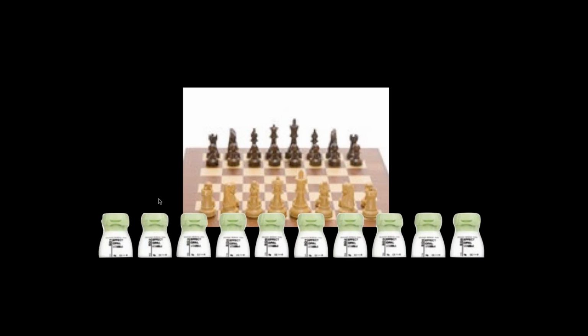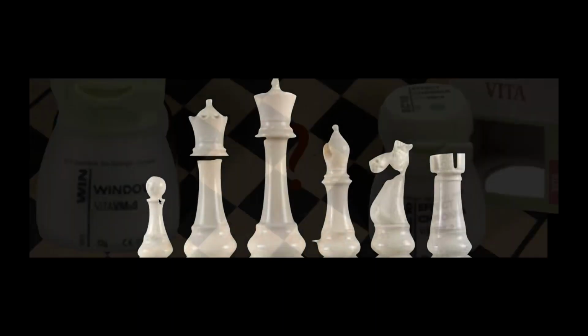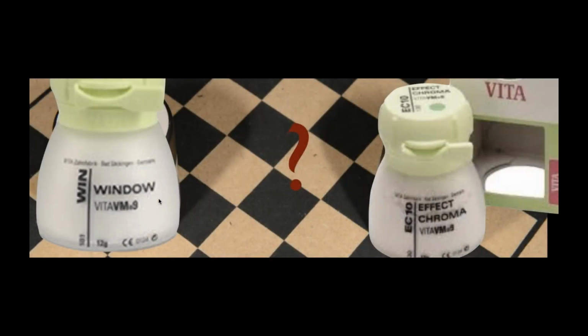And in this case, I feel like the fluorescent materials are really the ones that do that, whether they're liners, margin materials, flow dentins, or even Mamelon materials, which are also highly fluorescent. To me, those are what I would kind of call the queen of the kit. They have the ability to do the most in the most amount of space or the least amount of space. So that's why they're really the queens of the kits for me, and they really add a lot internally for us to work through. Our job really is kind of simple.